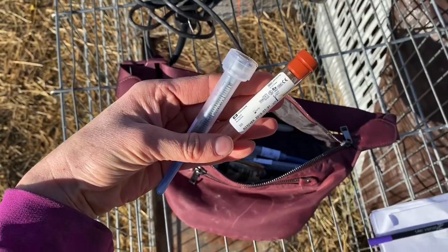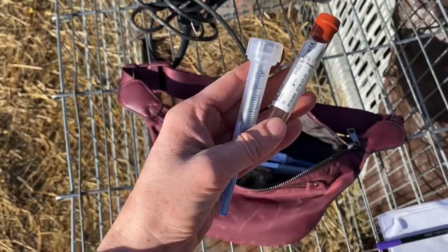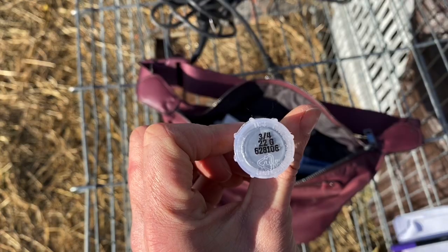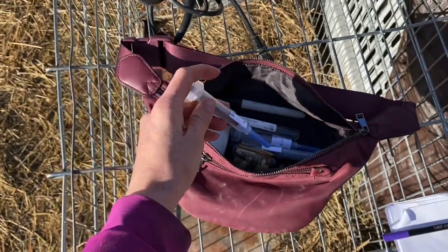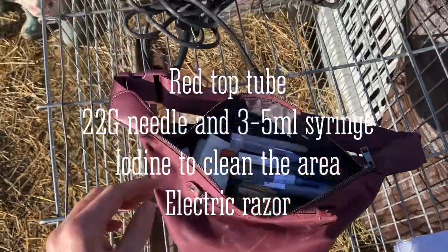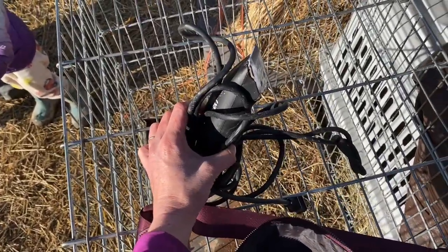The two most important things you're going to need: a red top tube to put the blood in and a needle. This is a 22 gauge. You can also do 20, and I have several of them in here just in case I end up needing to switch to a fresh needle. I also have an Andes electric razor — I'm going to shave a little patch on their neck so I can see what I'm doing.